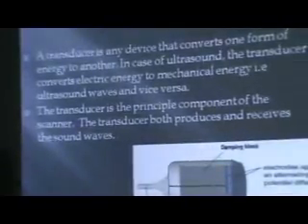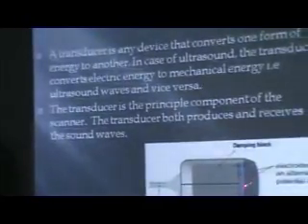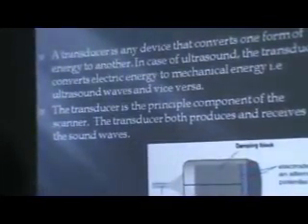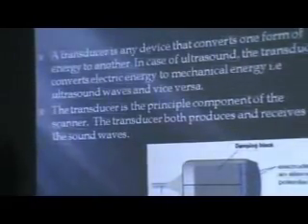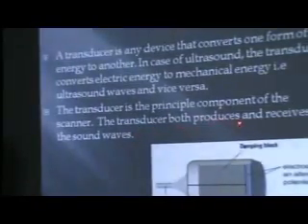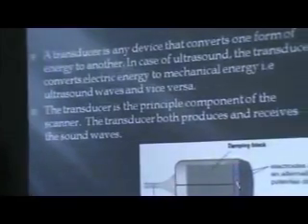And when the sound pulse comes back, it strikes the crystals and they produce electrical energy. So a transducer is a device which converts one form of energy to another. It is the principal component of the scanner, and the transducer both produces as well as receives the ultrasound waves.